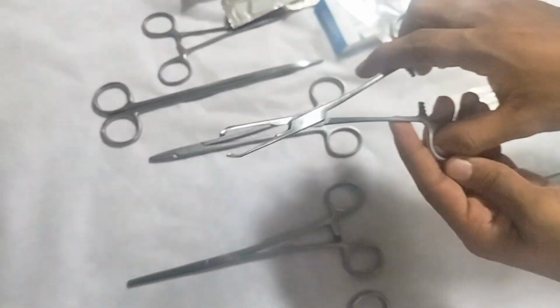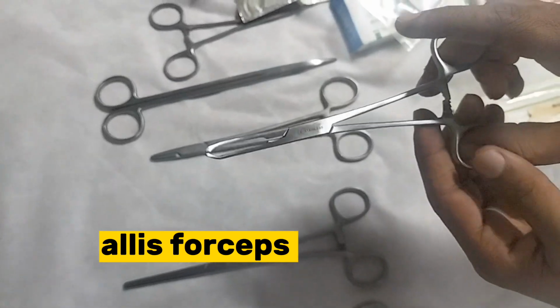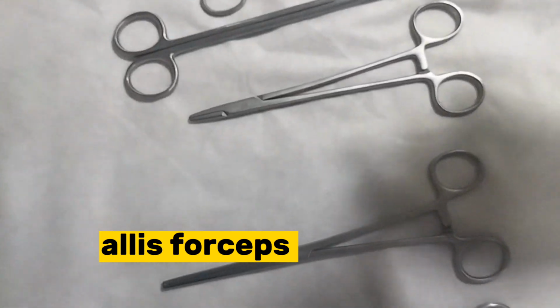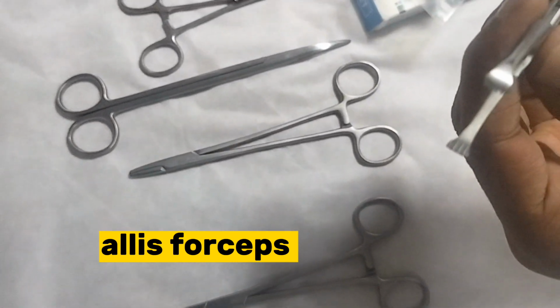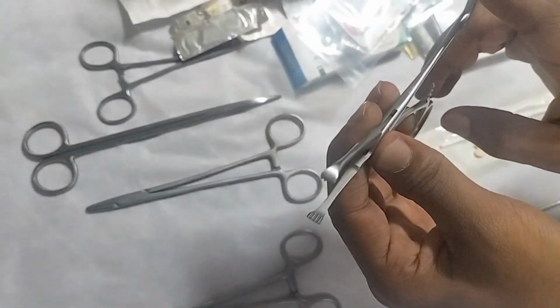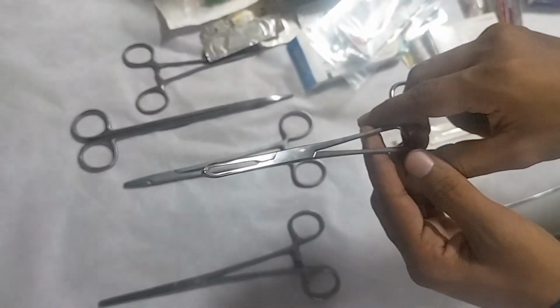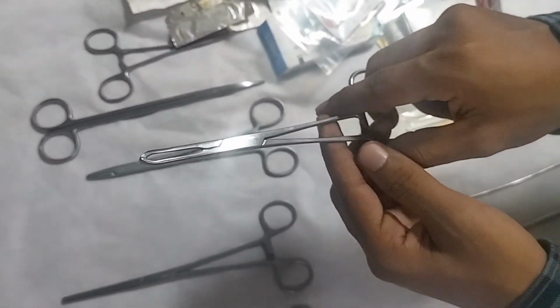Next thing. This is the Allis forceps. Okay, Allis forceps is one of the most commonly used, and it has small teeth. Even though it has small teeth, it is a traumatic type. It is used to hold structures during vaginal hysterectomy, and ligaments, broad ligament and ovarian ligaments. This is used to hold the ligaments.